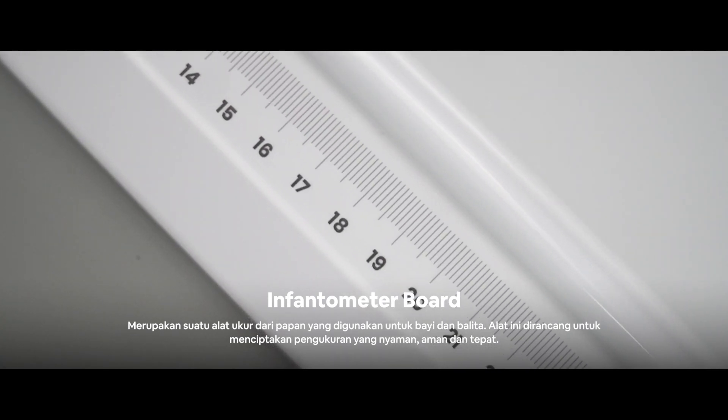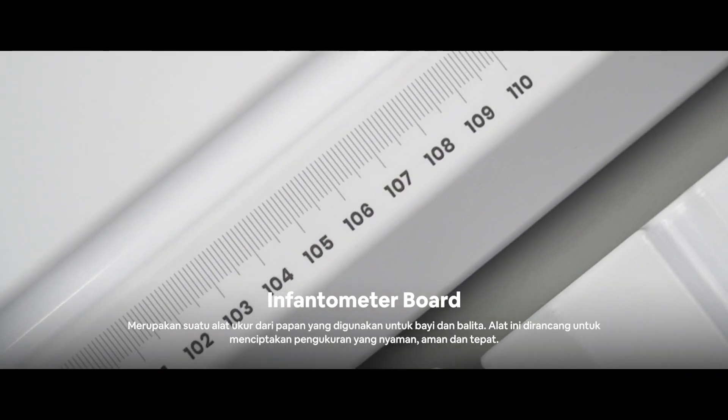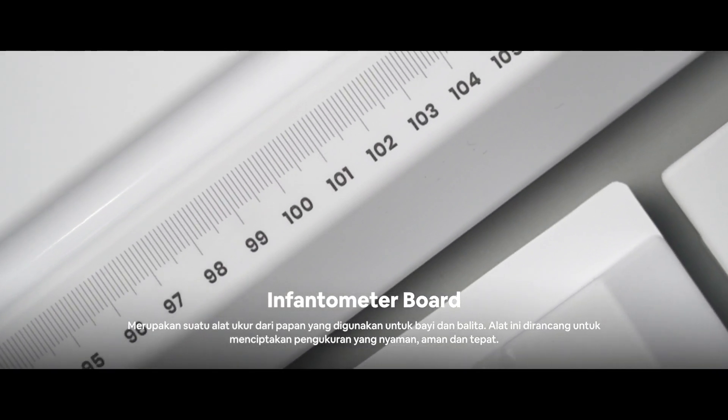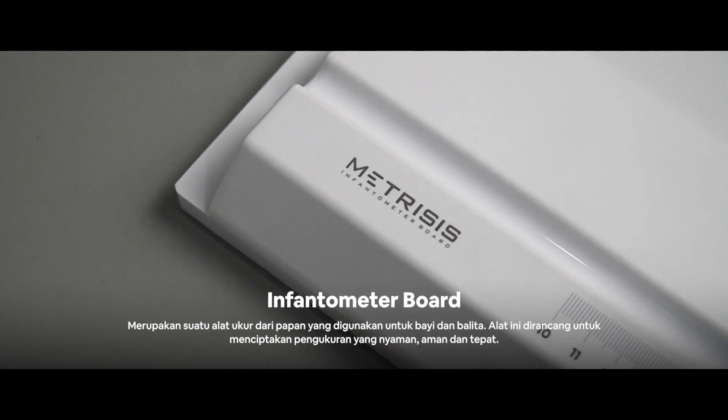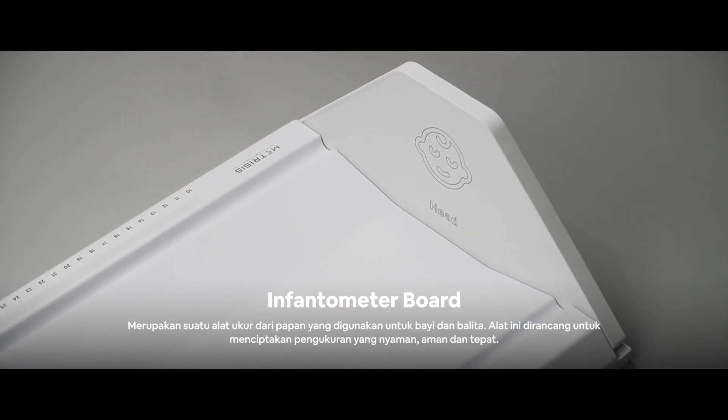Infantometer board is a measuring instrument in the form of a board, used to measure infants and toddlers. This tool is designed to make sure that the measurements are comfortable, safe and precise.